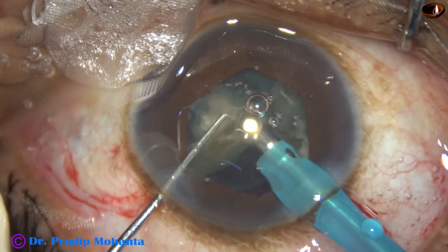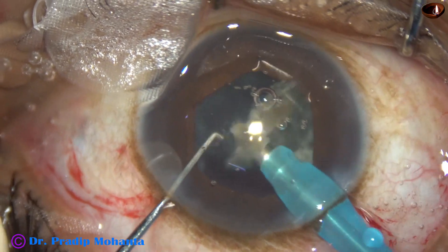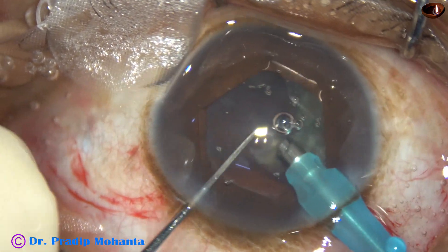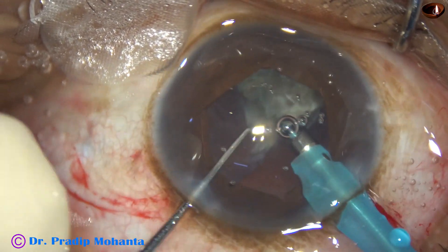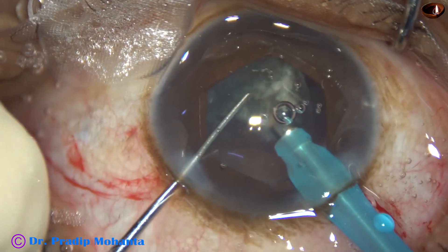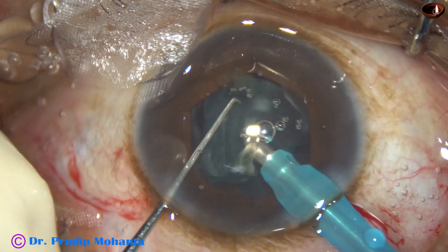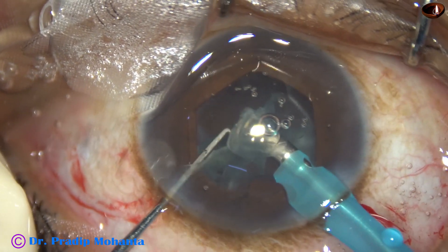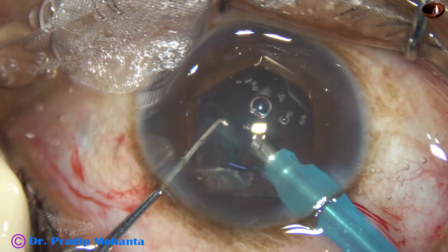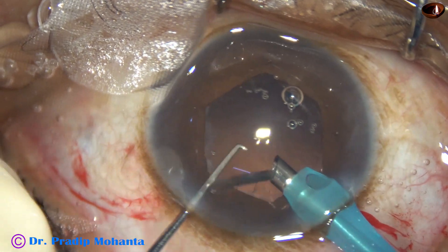You can see there is an air bubble sticking to the corneal endothelium. The air bubble is not moving, which means the fluid turbulence is not much — and that is a good sign, indicating the corneal endothelium is not being disturbed significantly.